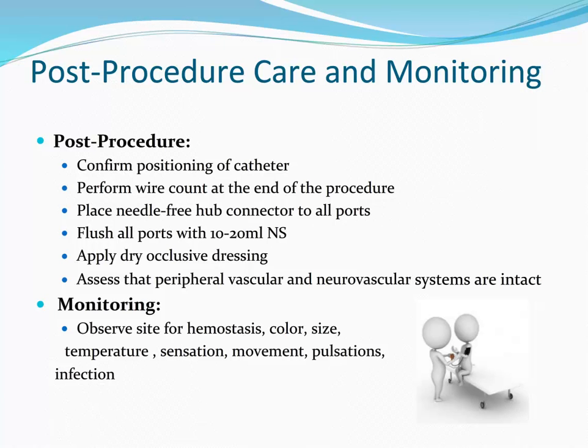Perform close monitoring post-procedure and every 4 hours thereafter, looking for hemostasis, circulation, sensation and movement, along with signs and symptoms of infection. These assessments are part of your CS Link every 4-hour documentation. So if you put a line in, make sure you have added these assessment items to your flow sheet, if they don't already exist.